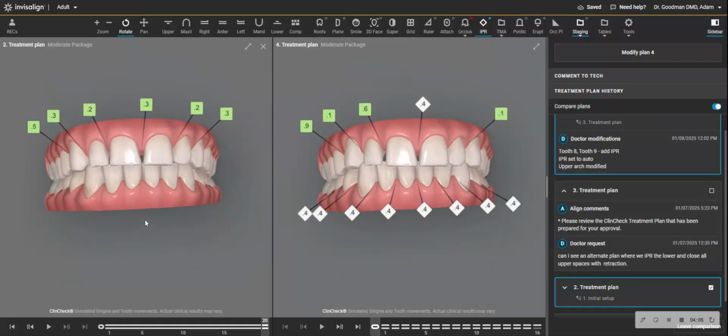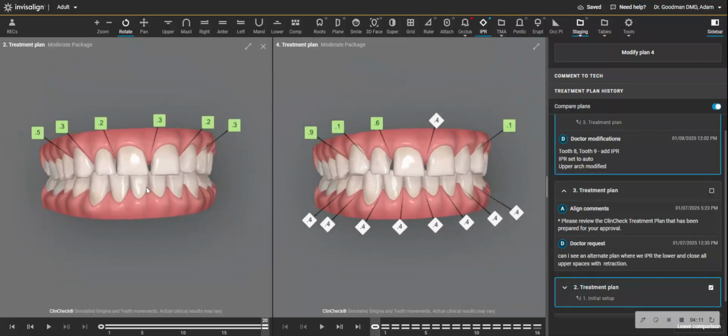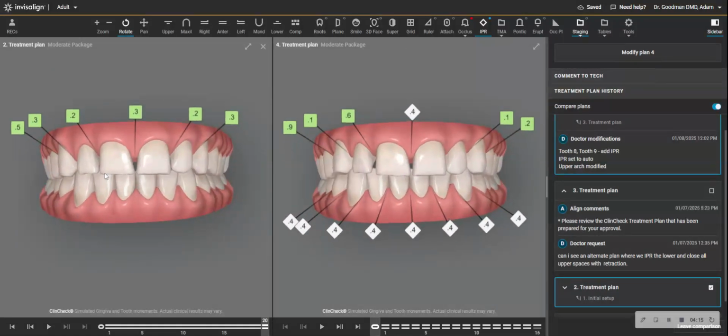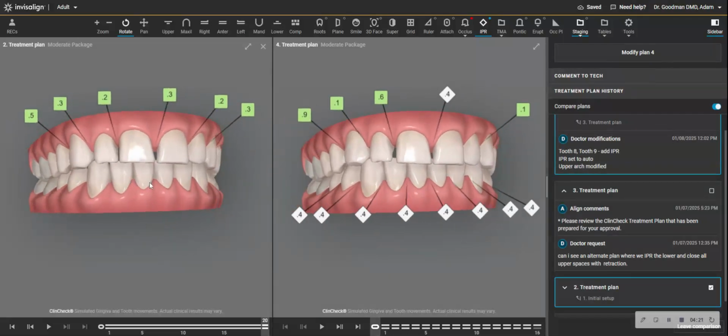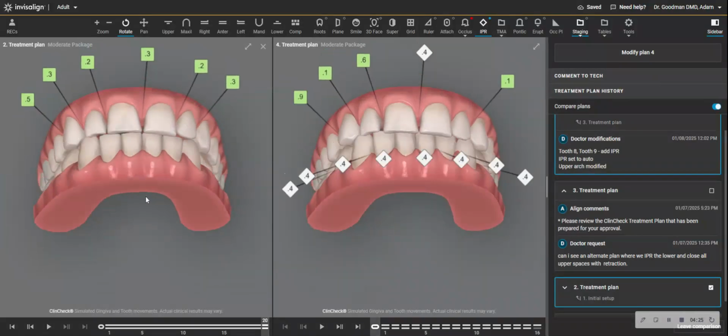And what the patient would do after the treatment is they would get restorations on the front 4 teeth, maybe even the front 6. And these teeth could benefit from restorations because they have a lot of enamel wear on them, and it would close the space and change the morphology of the teeth, and the bite would be balanced. We could even leave a little bit more clearance than you see here if we need to.